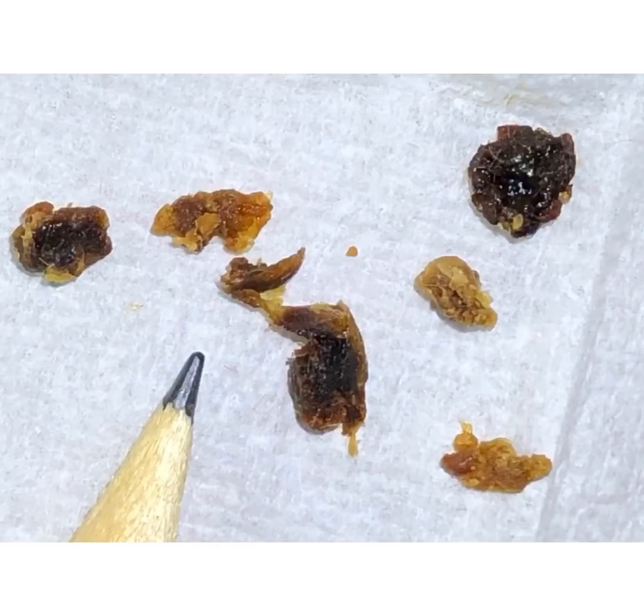So this is all the debris from that patient's left ear. You can see the different shades. Some parts are quite dark and they're oxidized. You've got some of the lighter brown, which is the fresher dead skin and wax, and that in time will oxidize.